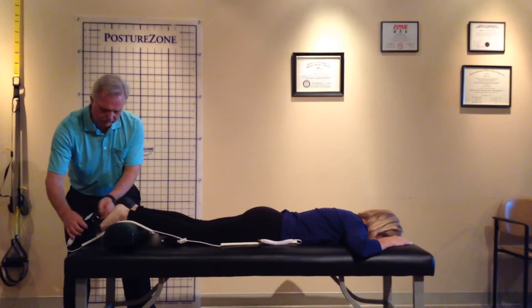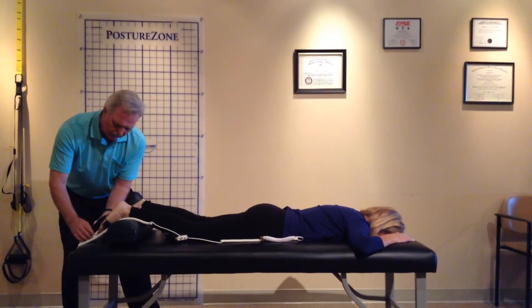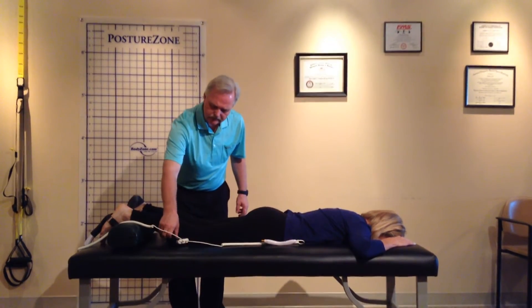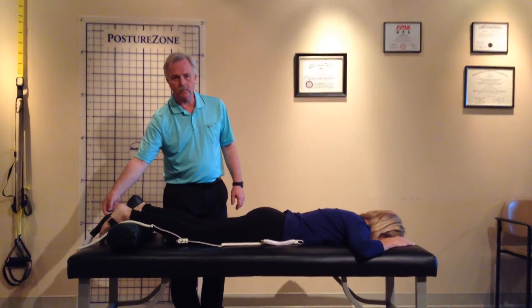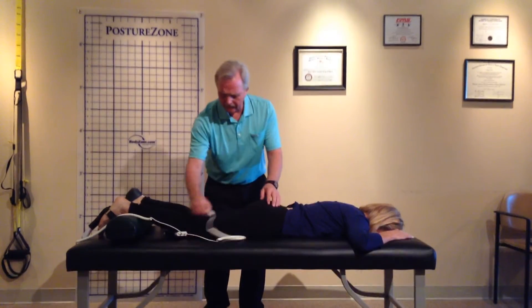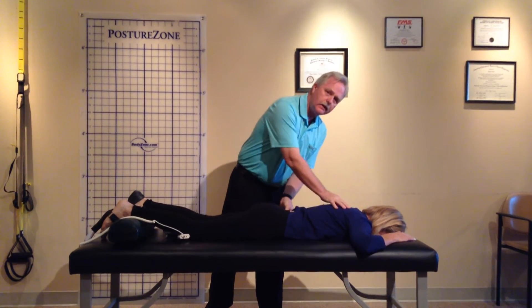So for example, we can simply put this over the foot if we've got a problem — an injury, a bunion, plantar fasciitis, whatever it might be. And stick this on here like that, and that'll stay working while we treat another area. Once I bring the cycles up — I'm going to use five cycles at this point — I turn it on. This is working back here while I'm using this probe to treat another area: the acupoints, the bladder points along the spine, any of the points that I can access.